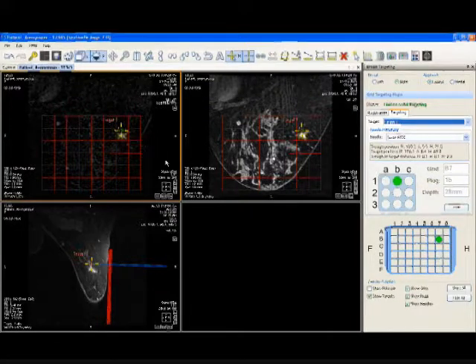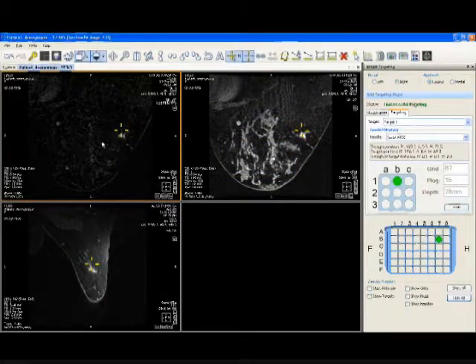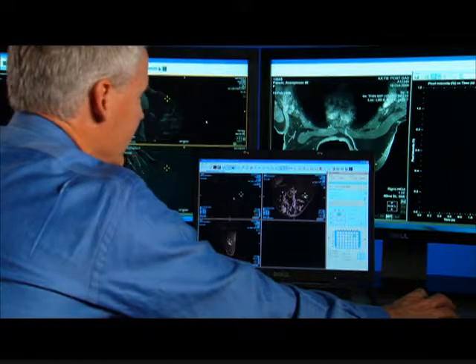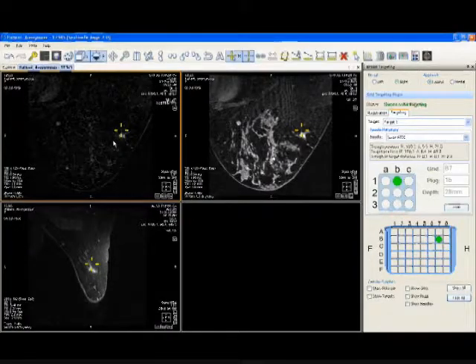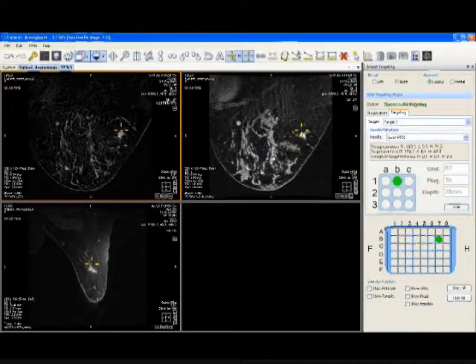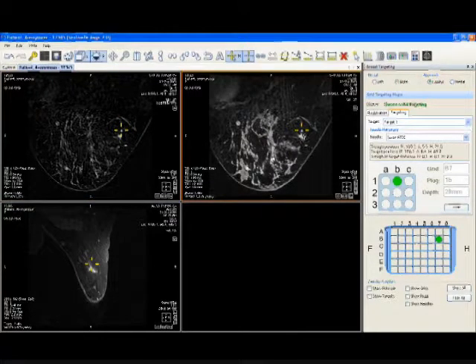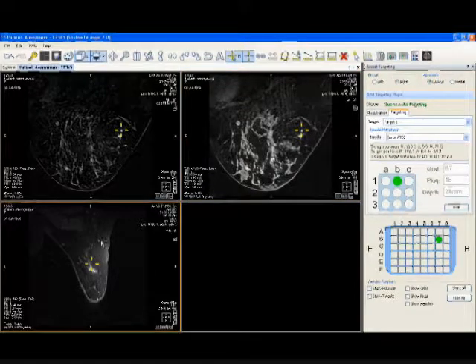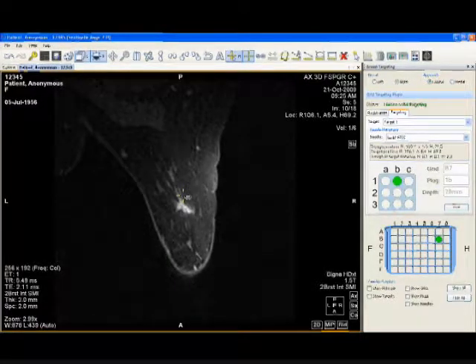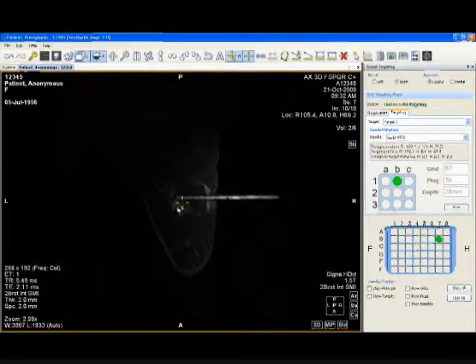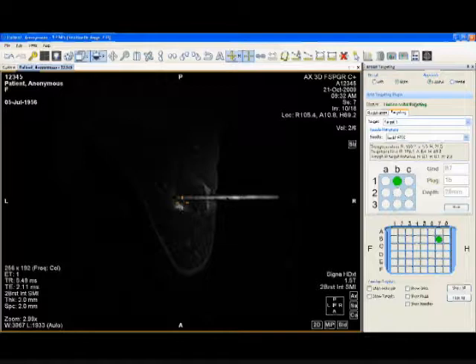Having done that, the next step as you insert the trocar is to place that. In this case there was a fair amount of resistance, so I advanced the trocar slightly greater than the 28 millimeters initially indicated, primarily for fear of tenting of the fibroglandular tissue. Now you see the obturator in place, and if you watch in the axial plane you can see pre to post-obturator there is some tenting of the tissue. After advancing it slightly more than indicated, the obturator is now centered pretty much on the lesion.